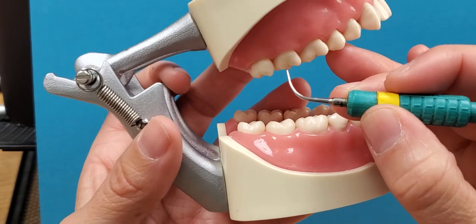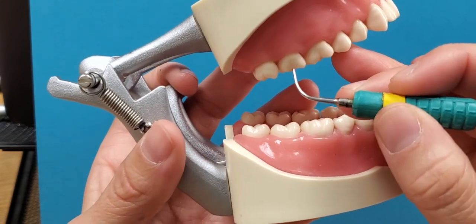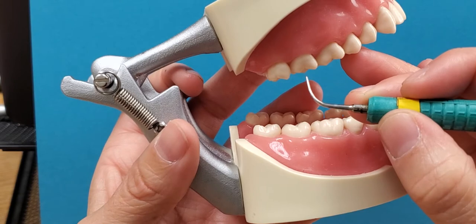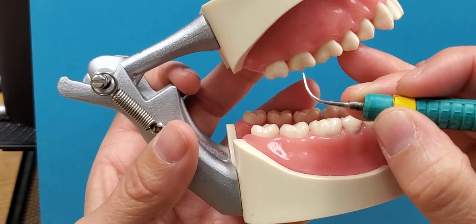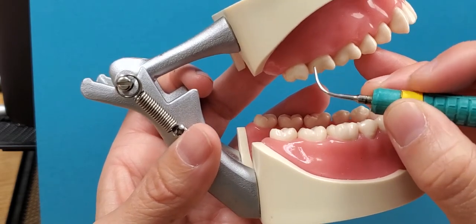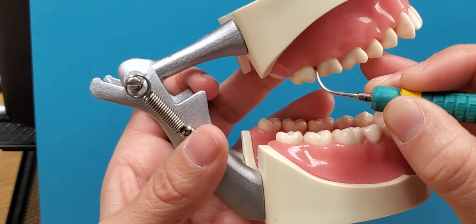All of your basic instrumentation rules apply to this technique, so you still want to have the modified pen grasp, you want to have a fulcrum intraoral one to four teeth away, and you're going to position the instrument just like you would a probe.